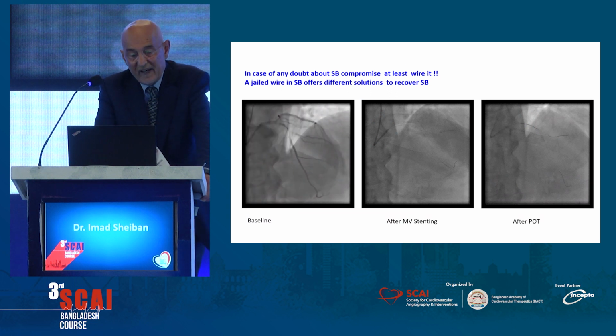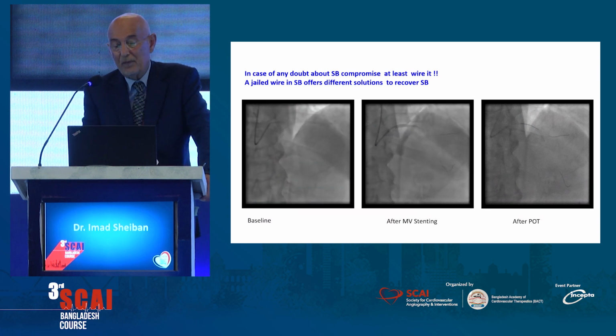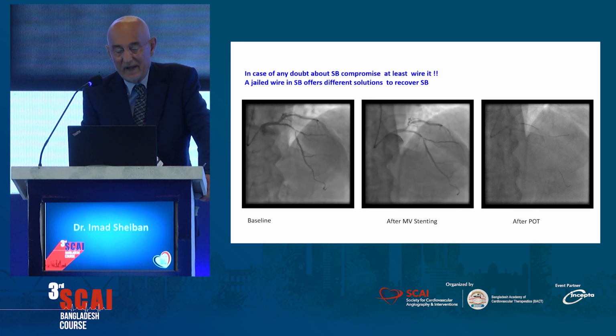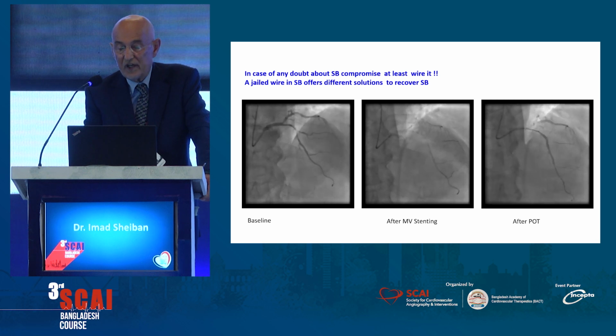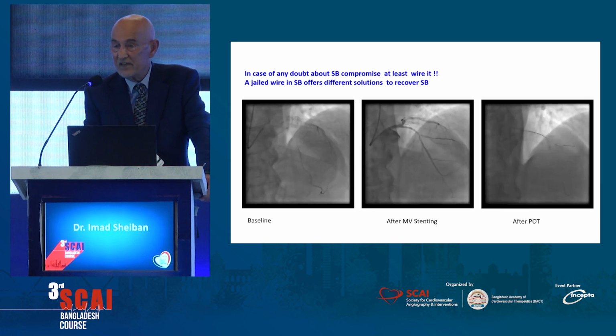In case of any doubt about side branch compromise, at least leave a wire in it. A jailed wire in the side branch offers a different solution to recover the side branch every time.